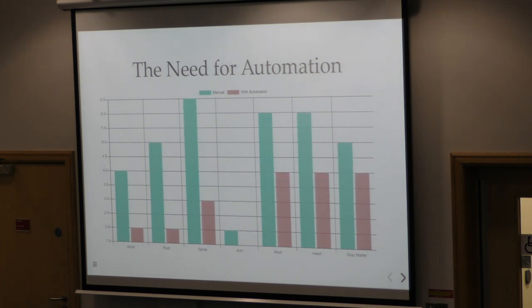Yeah. So effectively what Lucas said is that there's a bunch of ways that we use to do segmentation, and there's a good reason why there's a lot of interest in finding new ways to do it, and why there's still a lot of continued interest. The major one that Luke said was that this takes a lot of time, and also one factor that probably doesn't seem as important as it might otherwise is that it's a really boring task to do. And if we need somebody to do it accurately, we need them to maybe not enjoy it, but to get it done as quickly as possible so that they can focus their attention on the task.